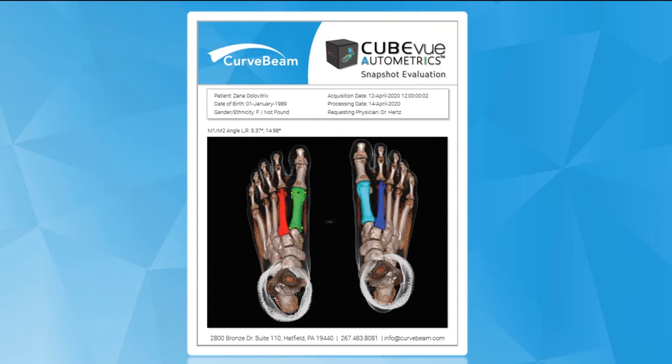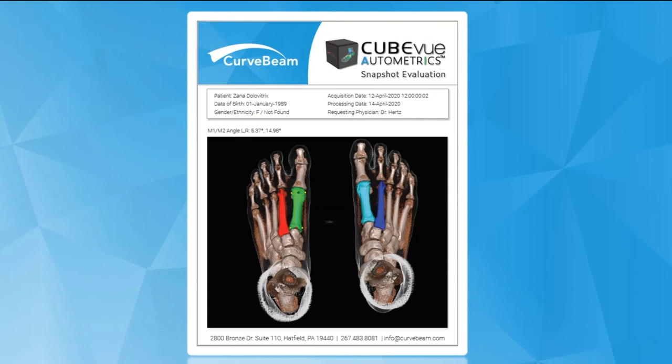The goal of Automatrix is to simplify your workflow by extracting snapshots of the most relevant information to your clinical needs and presenting it to you.